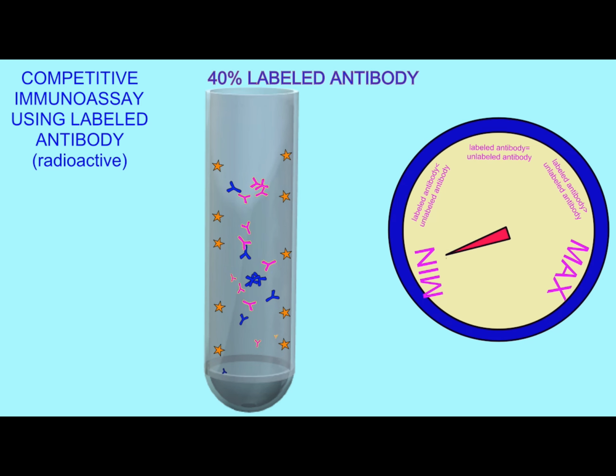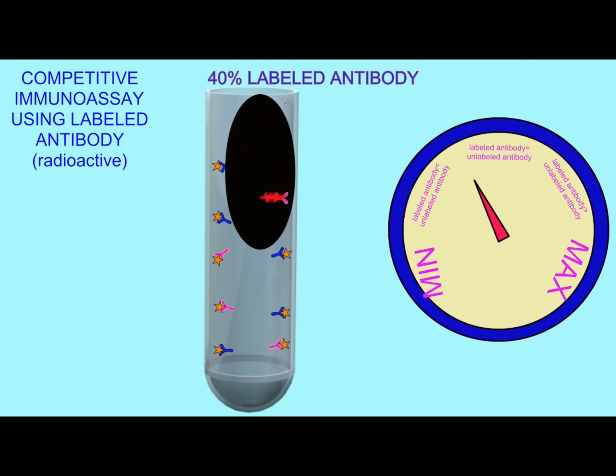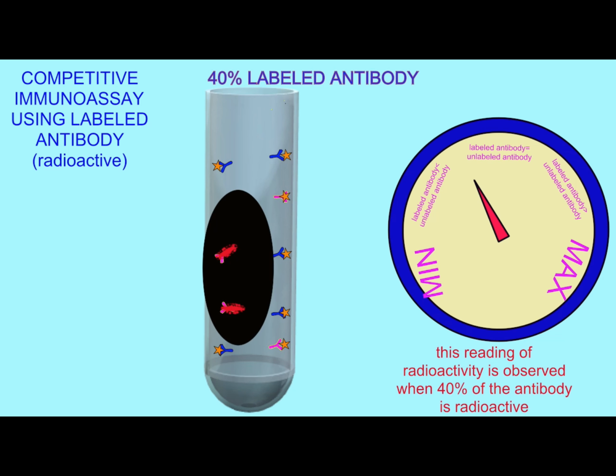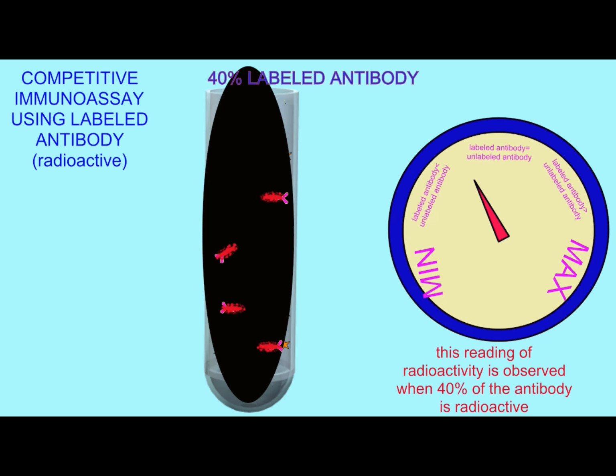also the relative amount, because the more antibodies which bind a specific antigen in the patient's plasma, the less of the radioactive label, which are also antibodies, will be able to bind the antigen, and then the lower the subsequent reading of radioactivity.